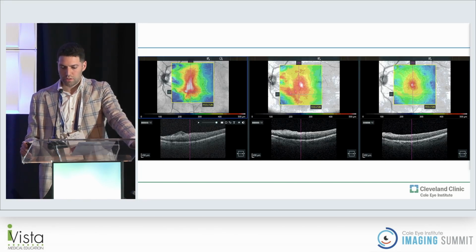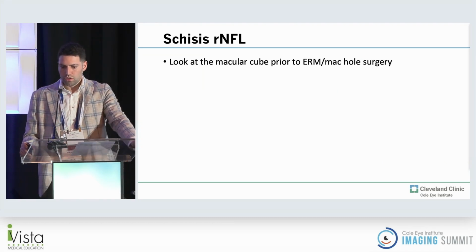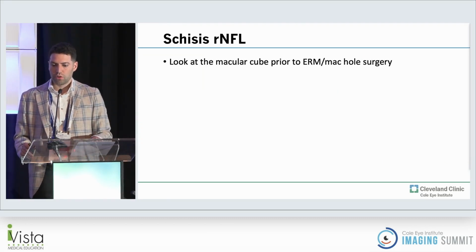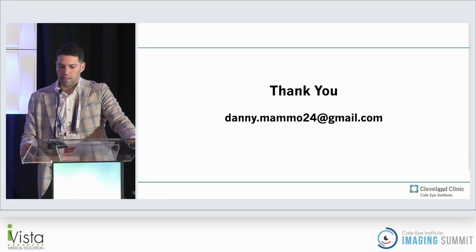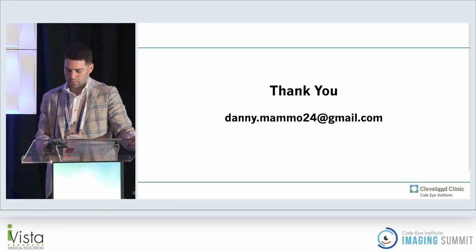And here's the last case. So for schisis of the RNFL, look at the macular OCT prior to ERM and macular hole surgery. Avoid peeling. Thank you.